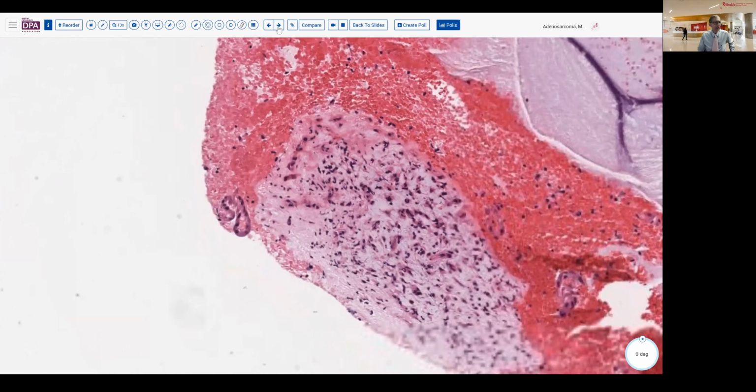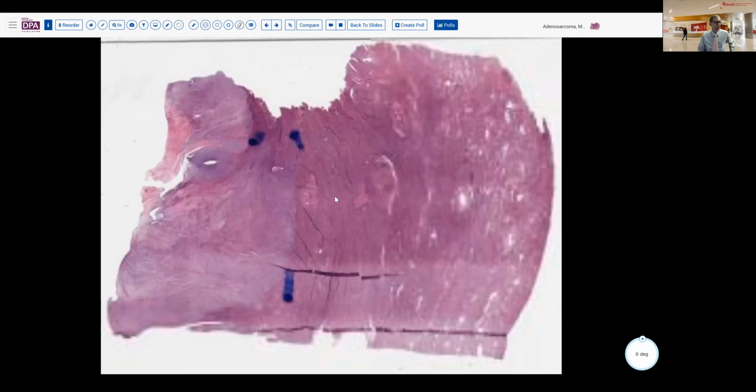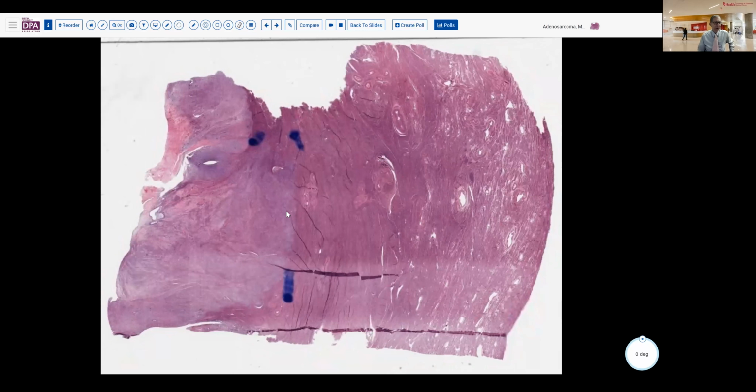So the next, as I've indicated, the next situation was the resection specimen. And in fact, here is that specimen. And we see grossly as well as microscopically that we have a tumor that is invading the myometrium. Here's the serosa here to the right. And here's this pale blue tumor, which has very little in the way of glands, just a few slit-like glandular spaces.